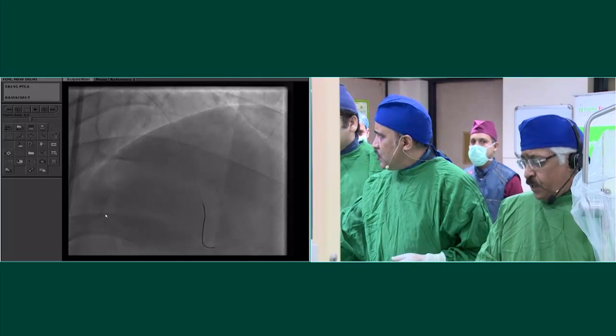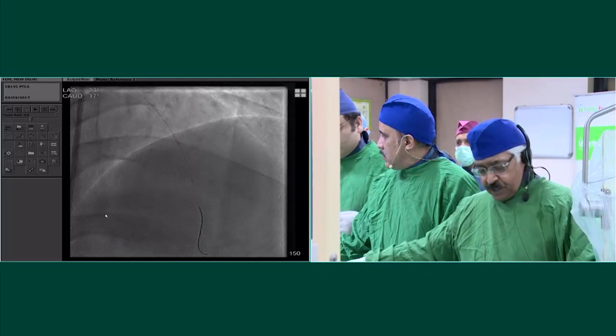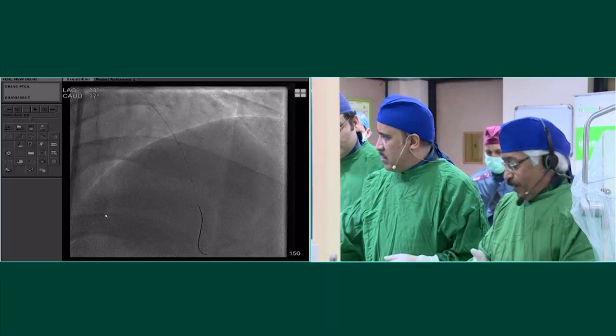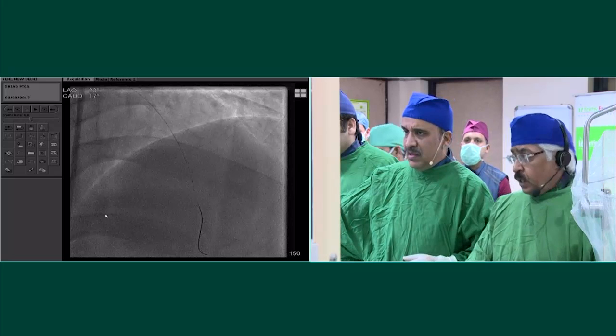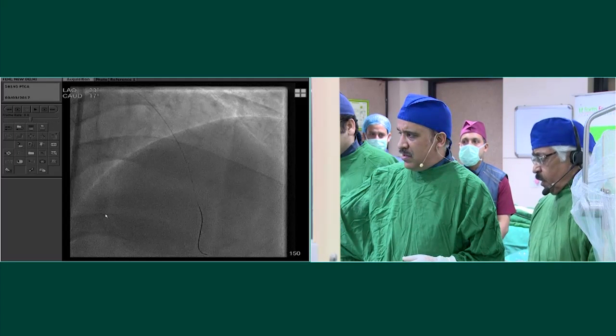That took us by surprise, didn't it? That circumflex. I'm totally stunned. I hope I can trust the FFR in the long term on this soft lesion. So yes, Flextome. You can take a 15. He's got soft lesion, so let's try that. It's a 3.5.